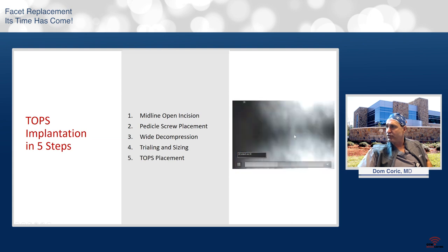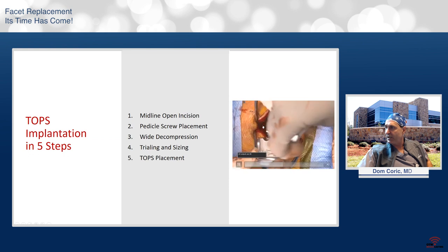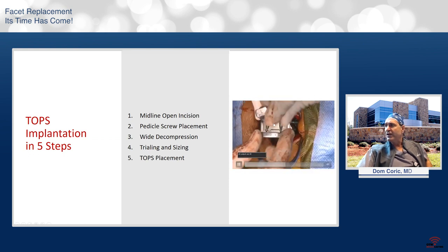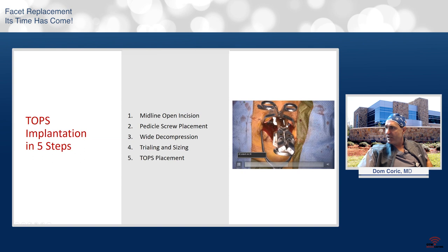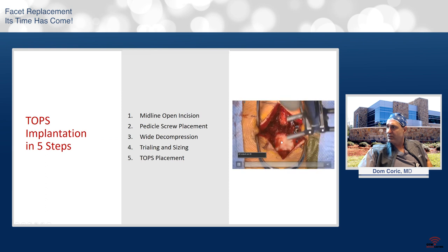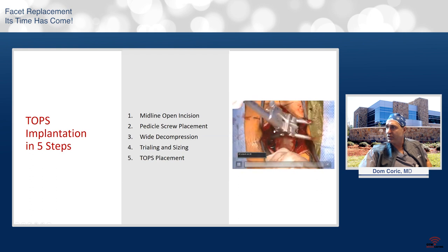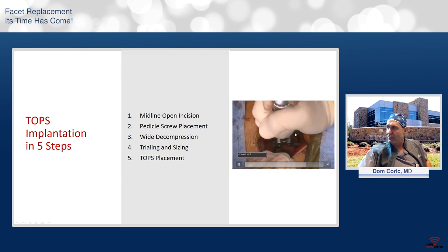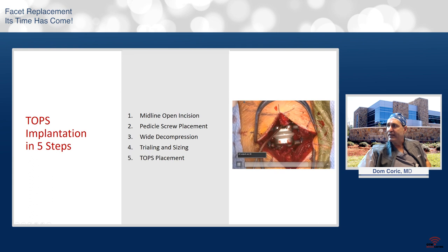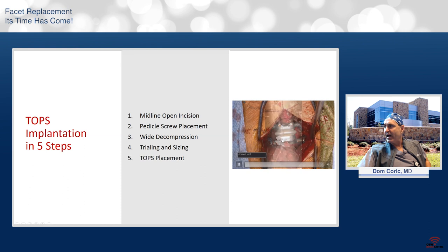We place the pedicle screws, and then now we're looking at the device. You can see the pedicle screws here and here. When the hands move, you can see the pedicle screw there. Here's the dura in the middle, getting the implant prepared. So we trial the device, we size the device, put a couple cc's of saline into the device, and then here's the device actually being implanted. It's pedicle screw based. There's the tulips. The tulips are turned laterally as opposed to caudal cephalad. And then here's the final device with the locking screws in. And again, how the device sits.